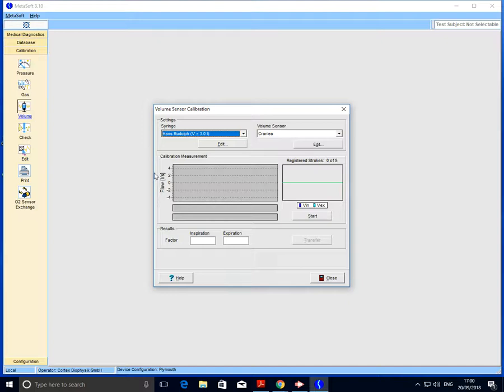If we grab hold of the syringe with one hand and grab hold of the handle with the other, the idea is that we fully retract the handle and then push it all the way back in with every stroke. For the volume sensor calibration to be registered and transferred, we need to complete five successful strokes. When I hit the start button, you'll see a computer demo appear—a blue line will go all the way out and back in. The idea is that we try and stay in time with that.